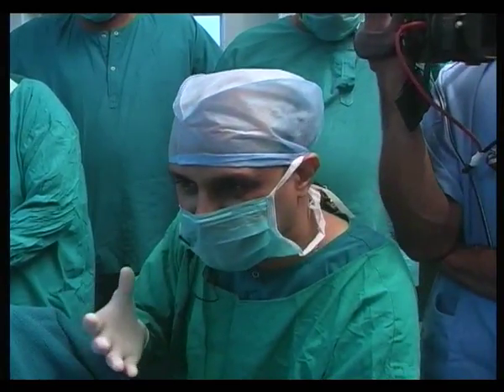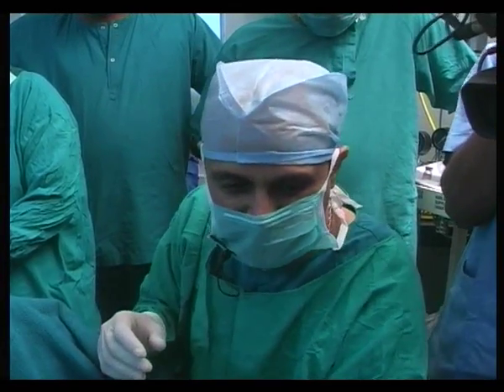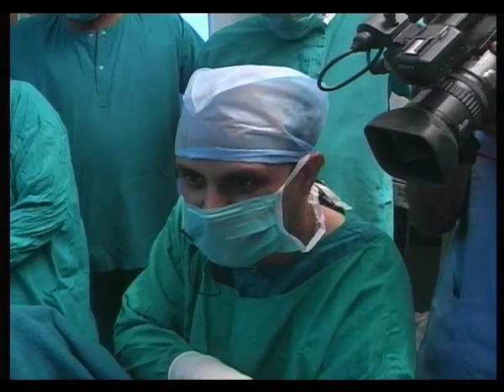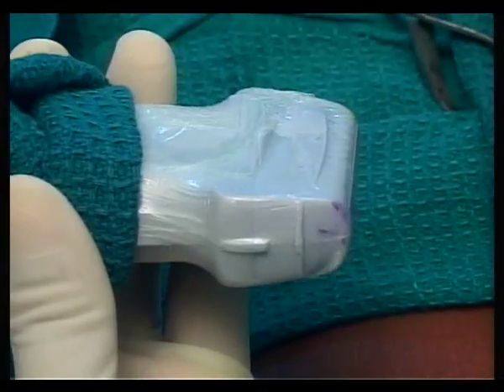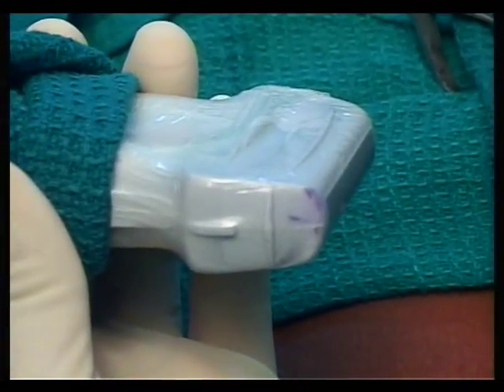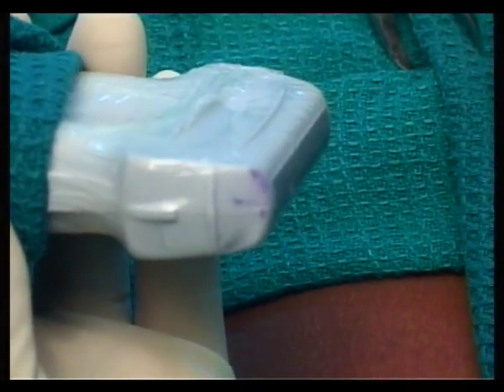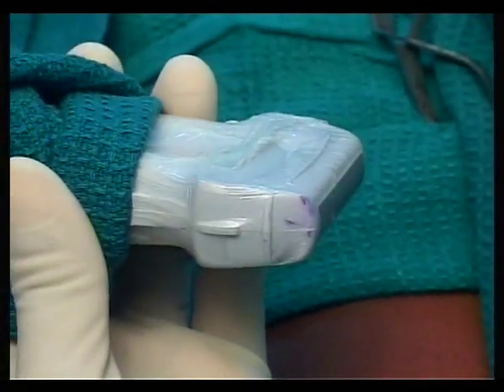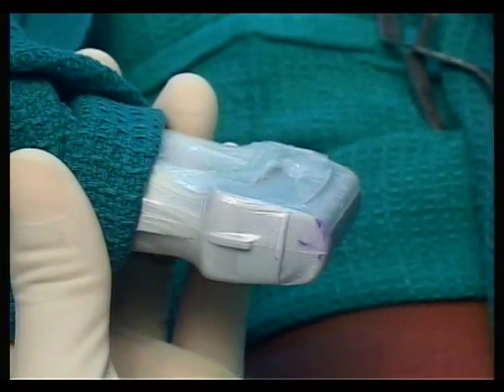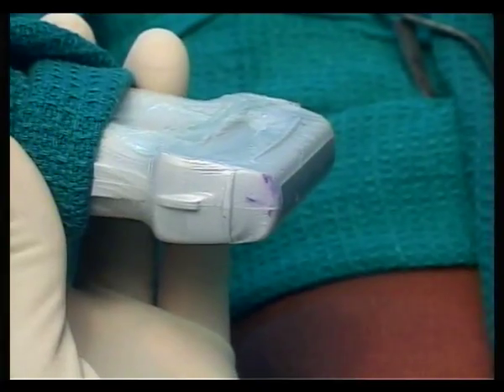The linear array transducer has a flat footprint — totally flat — and the beam it produces is just a one-millimeter slice. Wherever you angle that beam, those are the tissues through which it gets transmitted and reflected back to form an image. The angle determines whether you get an oblique, transverse, or longitudinal cut.